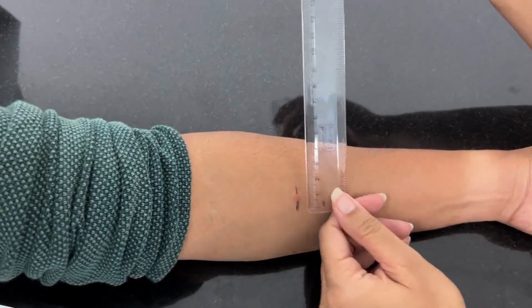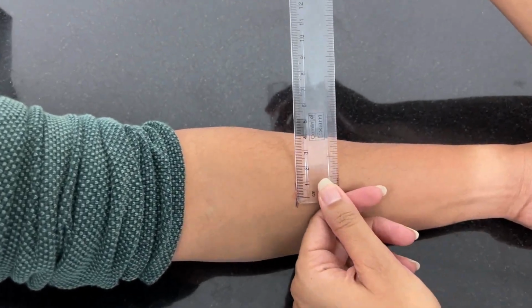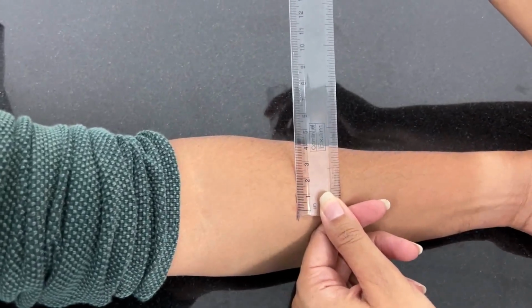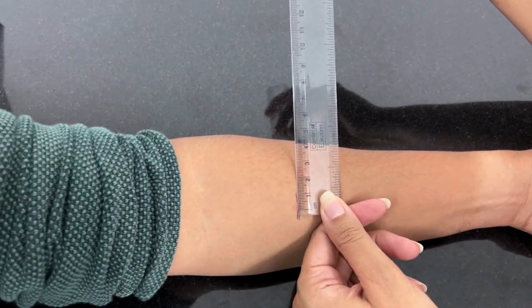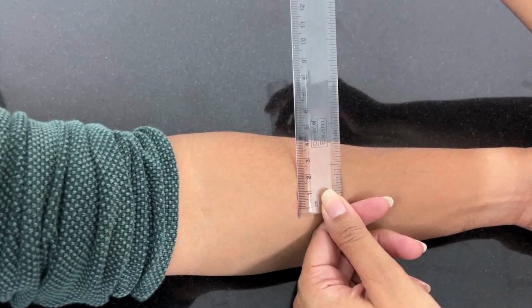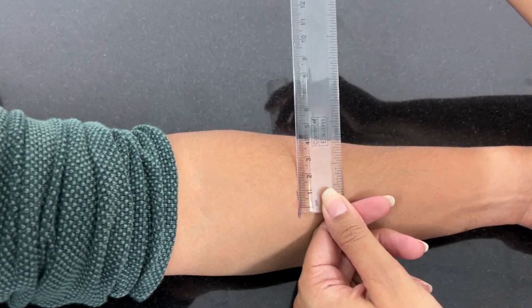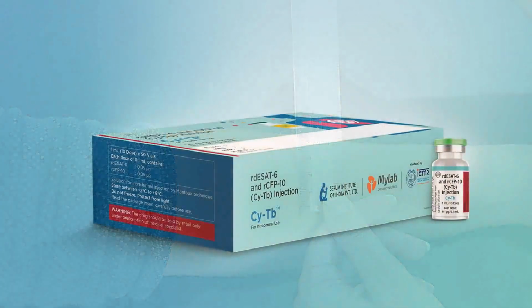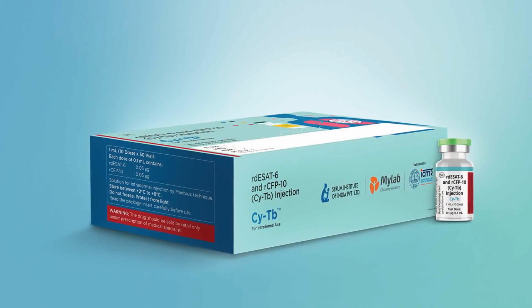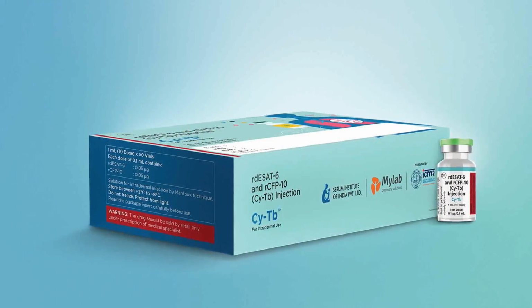Record results in mm of induration with size greater than or equal to 5 mm considered as positive for TB infection. 5 mm cutoff is universal for CyTb skin test irrespective of age, BCG vaccination and HIV status. Accurate and reliable detection of TB by CyTb is an important tool for disease control and tuberculosis management.